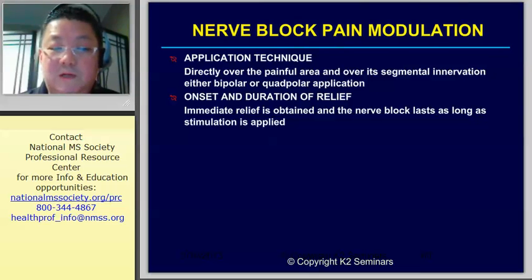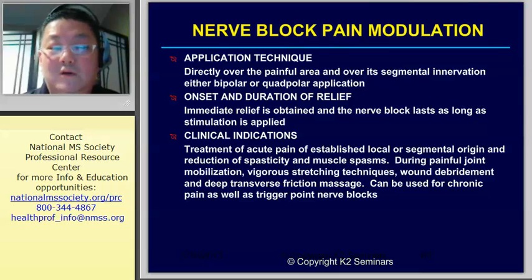Oops, move on to the next page. Application technique, you'll need to apply this directly over the area, above and below the area that you need to cause a decrease in function, if you would. You can either apply bipolar, 2 electrodes, or quadpolar, 4 electrodes.